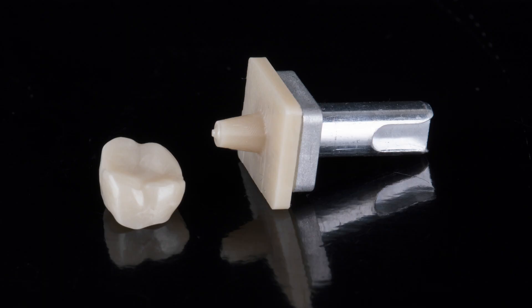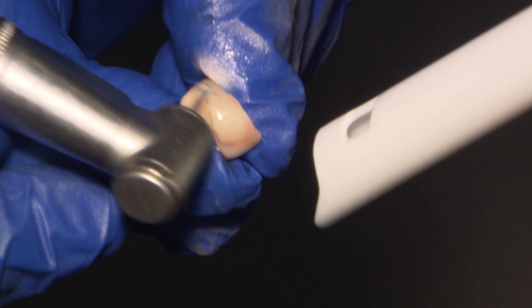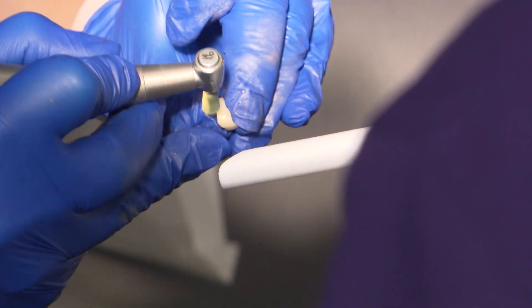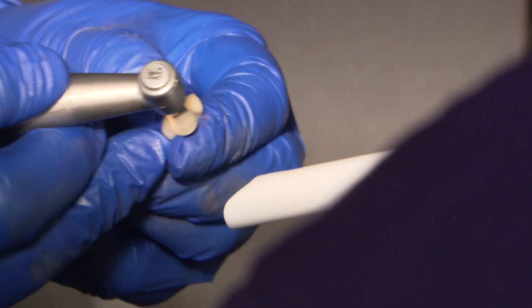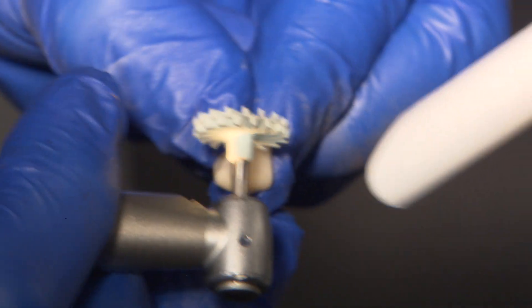"Now" is short for "no oven wait" because the BruxerNow zirconia crown is fully sintered and can go straight to patient delivery. Due to the design, minimal adjustments are needed. A smooth crown surface is important so that it will be less abrasive to the opposing dentition, so any adjustments are done with fine grit diamond burrs and polishing cups and wheels.